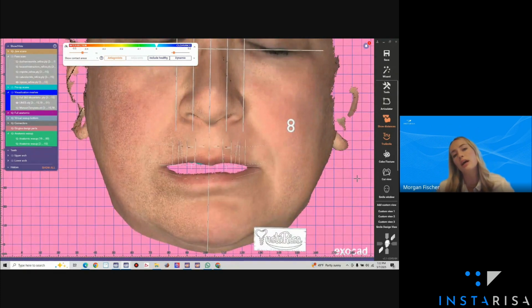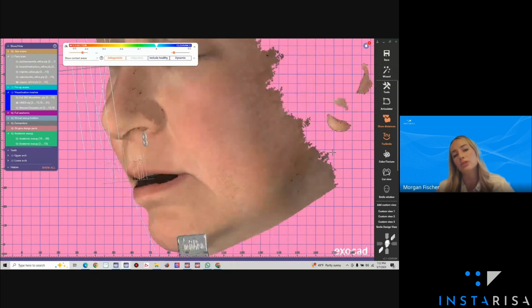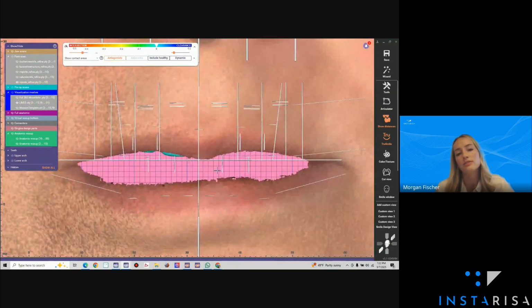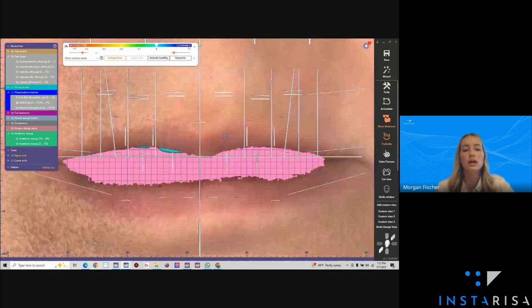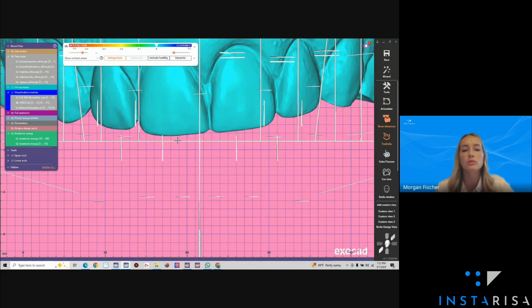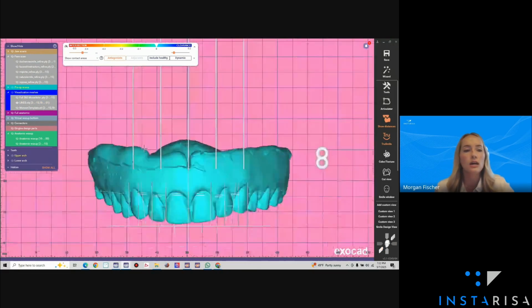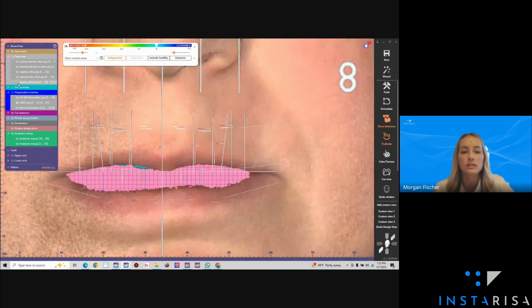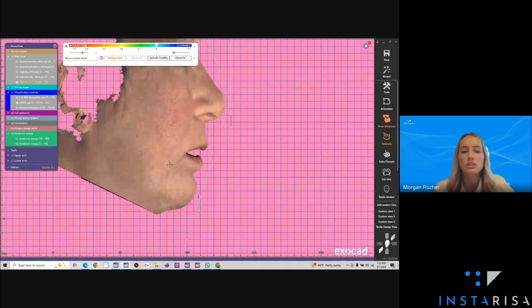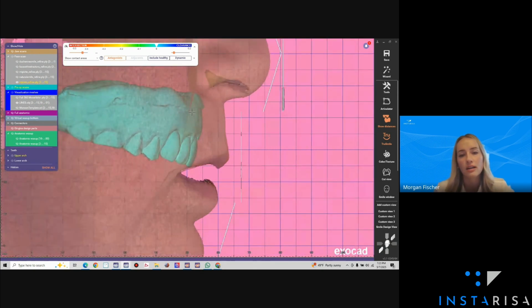I already decided the midline based off of when the patient was being articulated. So we decided on the midline here. And then if I zoom in, I am going to lengthen her incisal edge position. All of these grid lines in the back are about 1 millimeter. So we're going to lengthen it about 1 millimeter here, so that I can see 1 to 2 millimeters in repose. In the sides here, it's going to be a little bit higher, but I also know that she's wearing an upper denture. When I look at the side profile, I can tell that she has a lot of lip support here. And I know that a lot of that's coming from this denture flange, especially since we washed it.